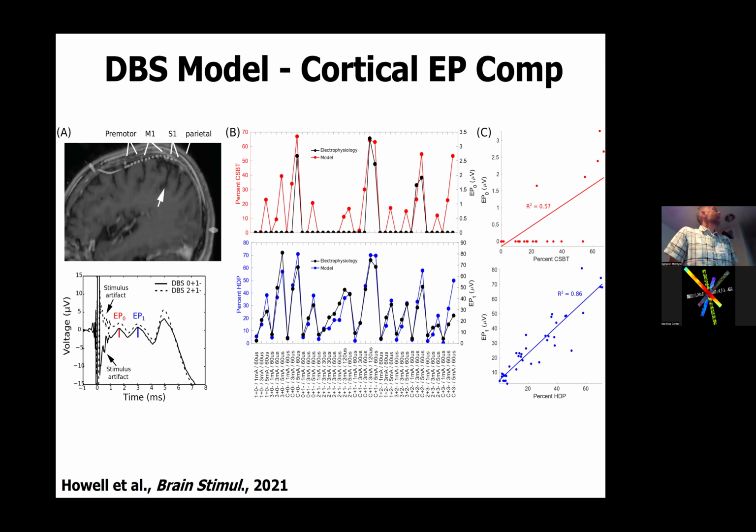And then you do that with many, many stimulation parameter settings, because you run these experiments in several patients, and in the operating room you go through all kinds of different settings, different electrode configurations, different stimulus amplitudes, different stimulus pulse widths, right? Then you look at whether our prediction of activation of the hyperdirect pathway lines up with the amplitude of the evoked potential wave that we know biophysically should be related to that signal. You go through that process, and it's a pretty good correlation, like, I don't know, 0.8 or something.